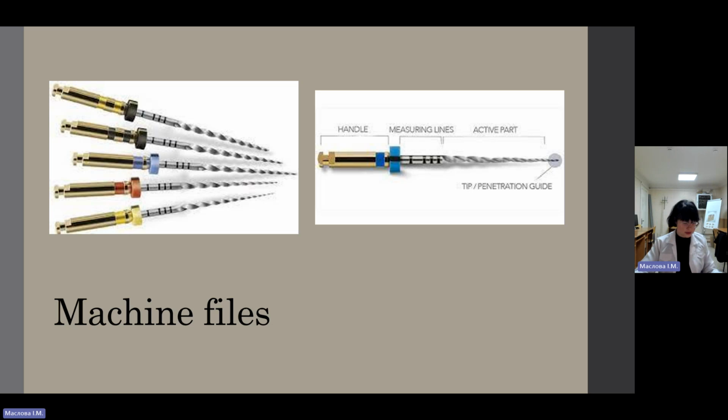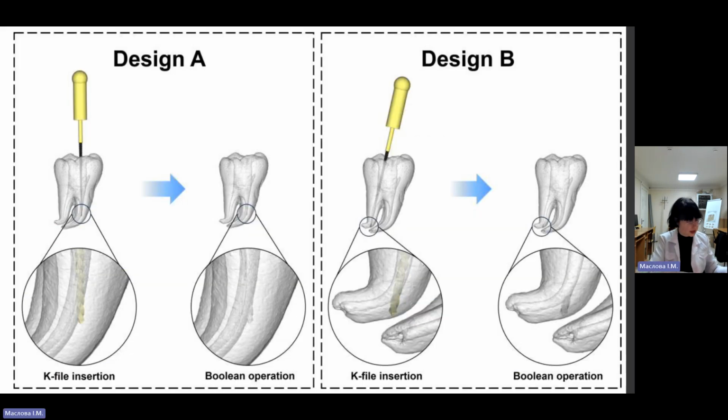Technically, endodontic treatment of teeth comprises three main phases that may be of equal importance for the outcome of the treatment. The three phases or stages are preparation for treatment, root canal instrumentation, and root canal obturation. A few words I have to tell you about the properties and advantages of the instruments for the root canal.